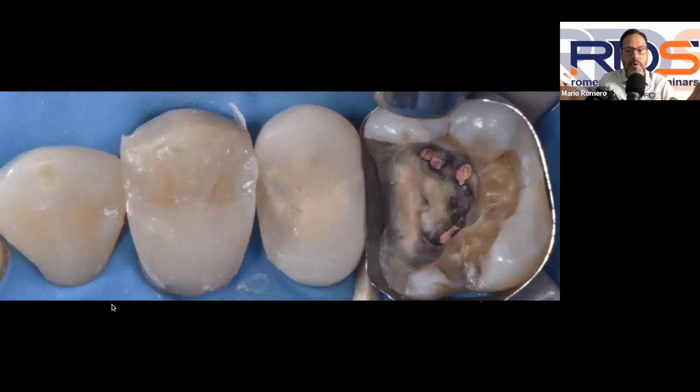Now, when we're talking about rubber dam isolation, you are seeing on this photo, I have a W3 clamp sitting directly onto that first molar. So that first molar is where my retentive clamp is going to be. At the same time, I have to create enough room for me to place a band so that I can elevate that margin. But the most important thing you need to understand is that because that margin is deep, you're going to have to push that rubber dam slightly subgingival. You need the septum of that rubber dam to go subgingival so that you can get complete control of the crevicular fluid and any bleeding in the area while you are performing any clinical procedures here.